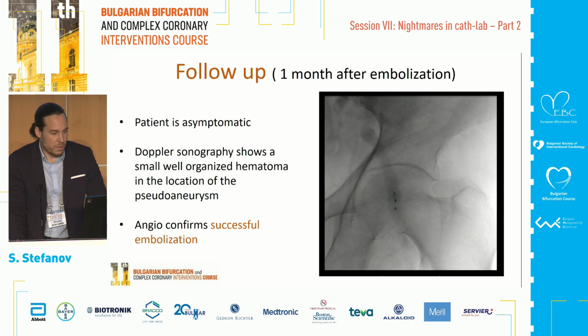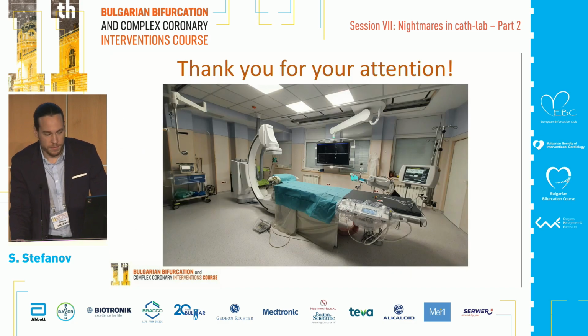So at follow-up, the patient, 1 month after the embolization, came to us asymptomatic. From Doppler sonography, we had organized hematoma with small dimensions in the location of the previous pseudoaneurysm. And the angio we did confirms successful embolization of the pseudoaneurysm. So thank you for your attention.